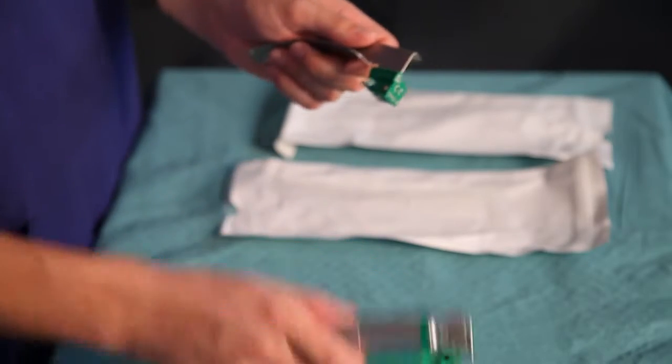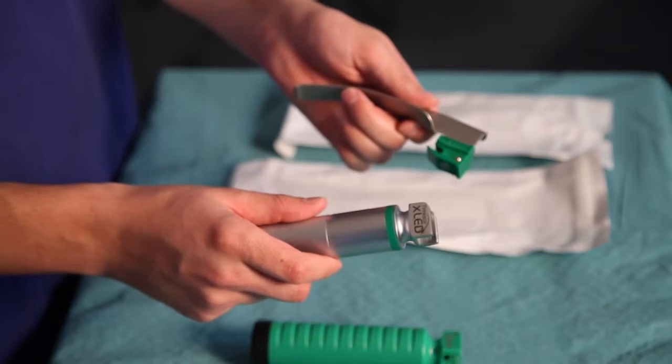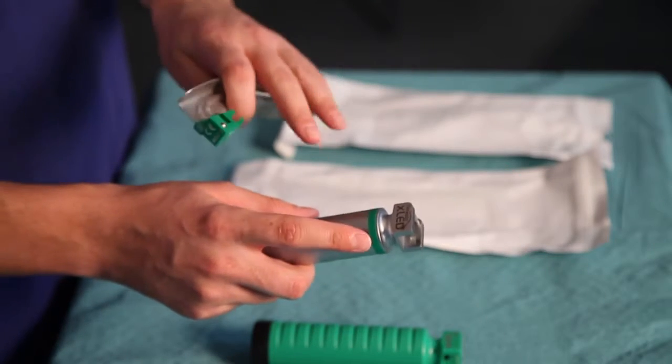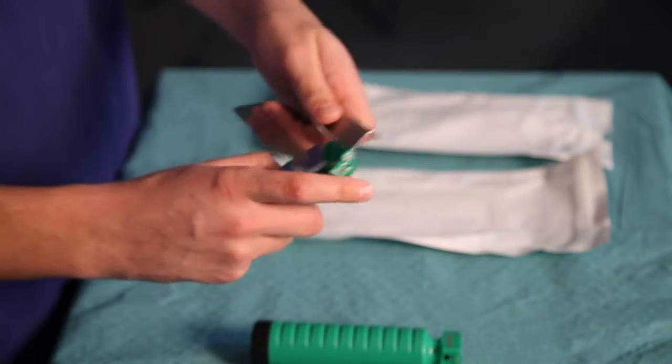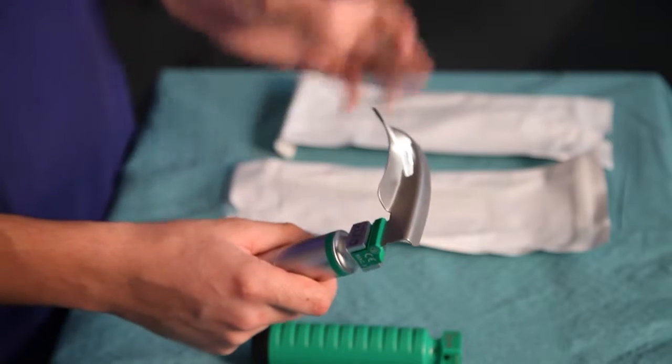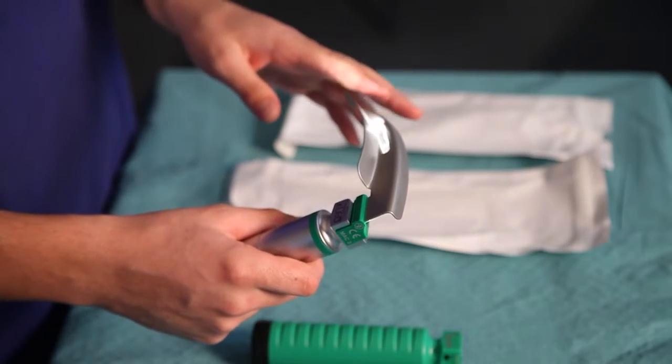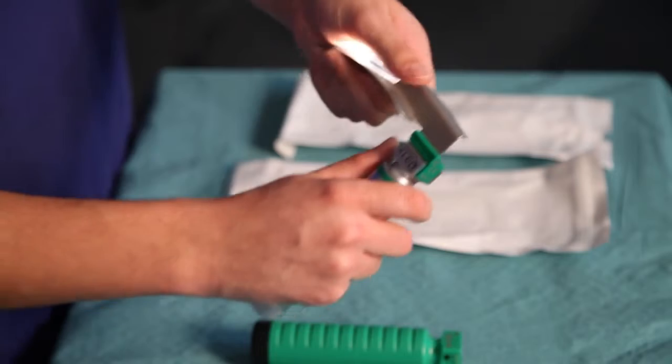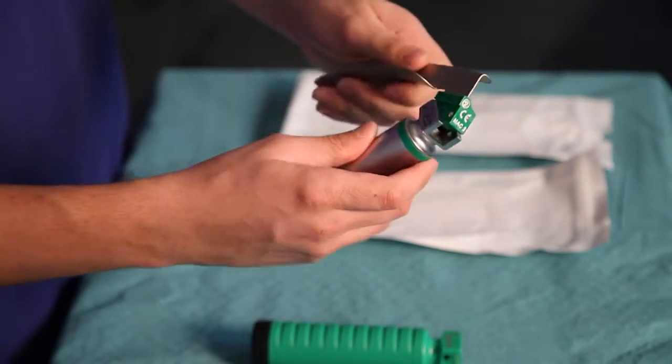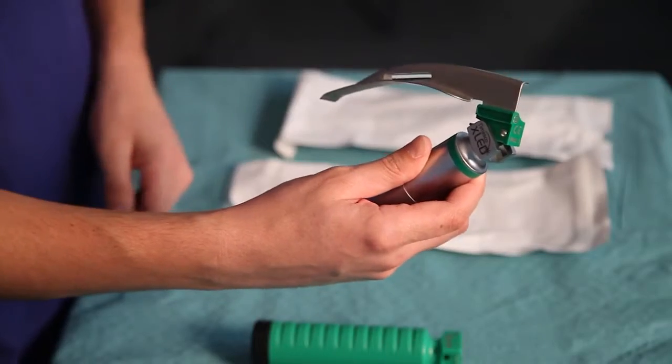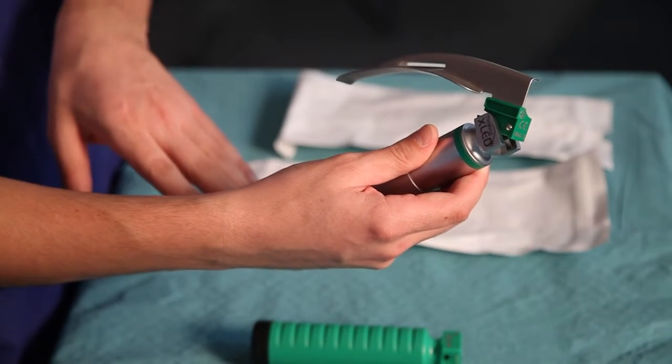If you're looking to use a reusable handle with a single-use blade, you've got the ISO 7376 spec so this is fully compatible. There's also an extra benefit of non-touch, which means that the blade will never touch the handle at rest, which is great for cross-contamination reduction.